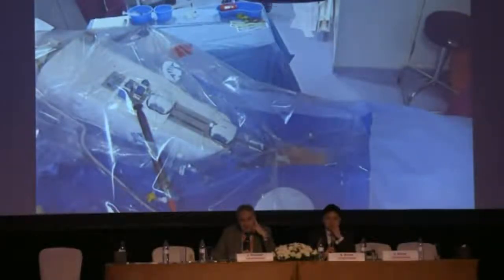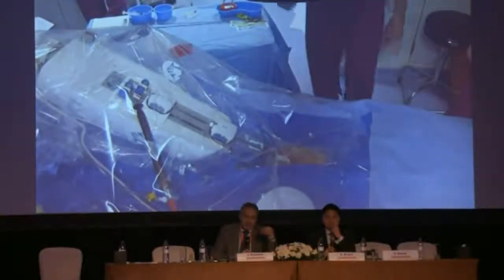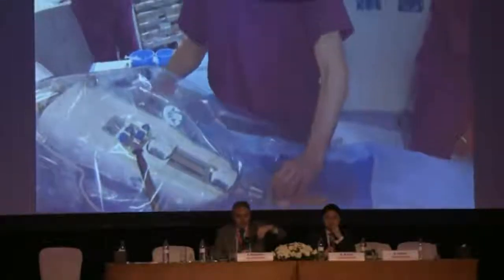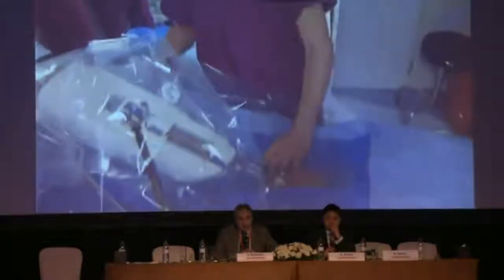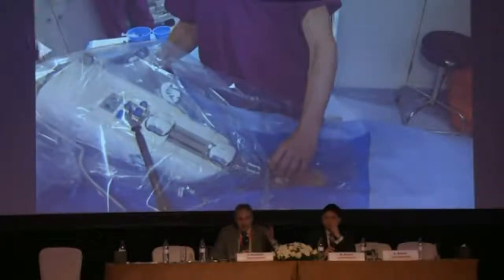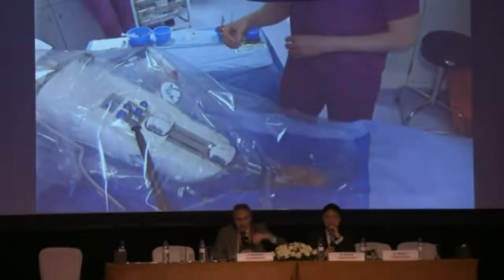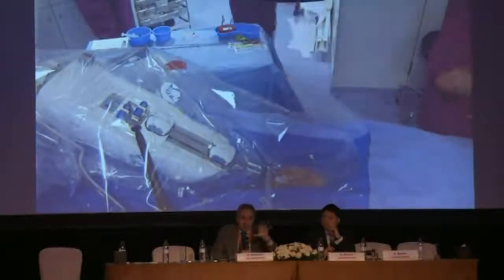So the least, let's say, attractive line for us is the mitral isthmus line, because it is a very difficult area. And as I mentioned at the beginning, there is usually input from the epicardium, from the area of the Marshall vein. So in some cases, it's really difficult to ablate endocardially, even though you ablate in the coronary sinus, but it's close to the valve and not usually in the area where you need to ablate, in the area of the Marshall vein. So this is important to emphasize here.